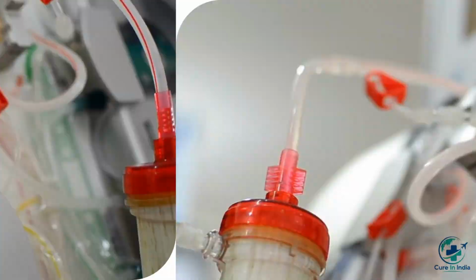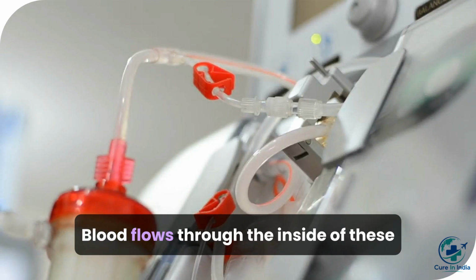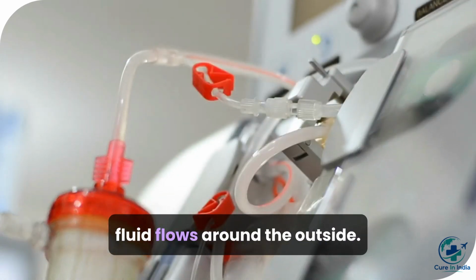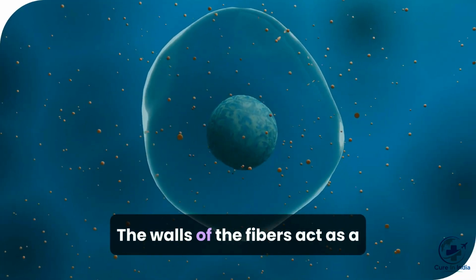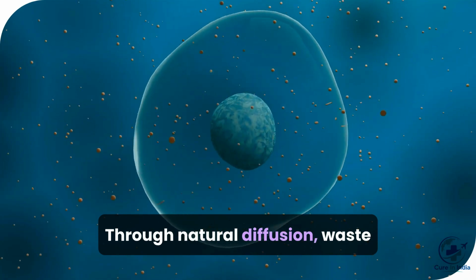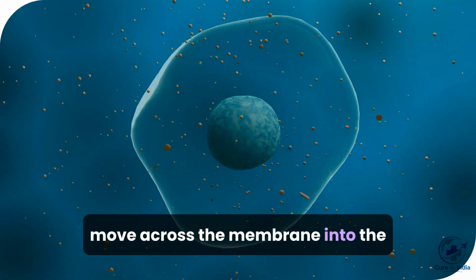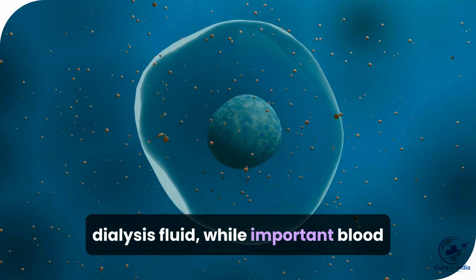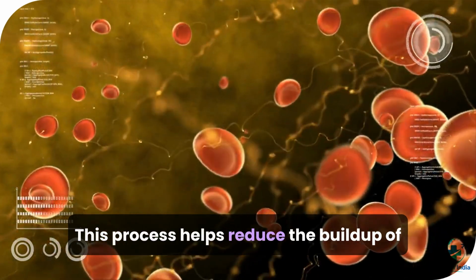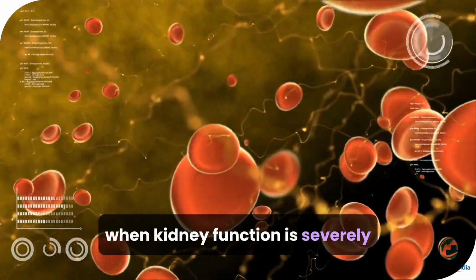an artificial kidney. Inside the dialyzer are thousands of tiny hollow fibers. Blood flows through the inside of these fibers, while a specially prepared dialysis fluid flows around the outside. The walls of the fibers act as a semi-permeable membrane. Through natural diffusion, waste products and excess substances can move across the membrane into the dialysis fluid, while important blood components remain inside the bloodstream. This process helps reduce the buildup of toxins that would otherwise accumulate when kidney function is severely reduced.